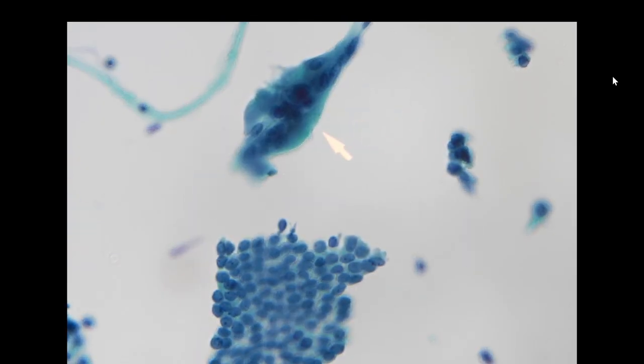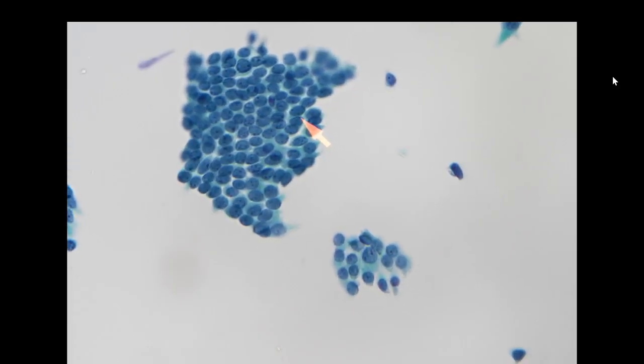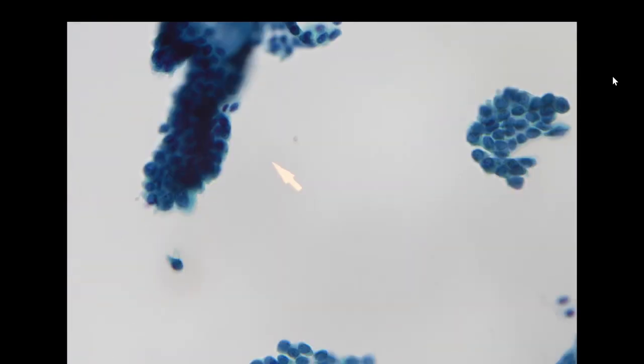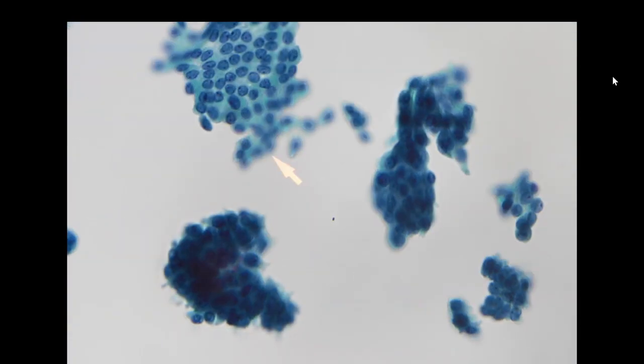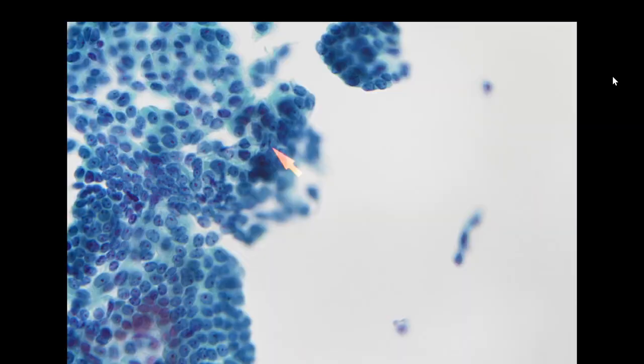On high power, we do see multinucleated giant cells, and we will usually search for nuclear inclusions in the monolayer sheet area. Here we do see the cells are relatively monotonous with an oval shape, a little bit of disorganization, some with grooving. Giant cell here as well. So we can look for pseudoinclusions because it is very classic. We didn't make a dot, but I think it's there. So let's take a look.